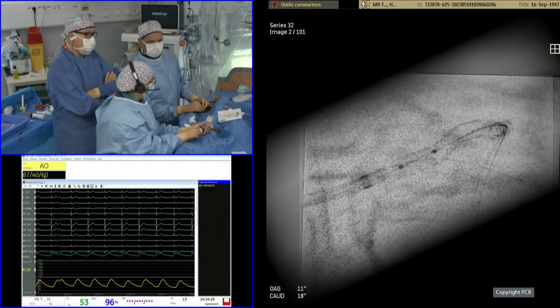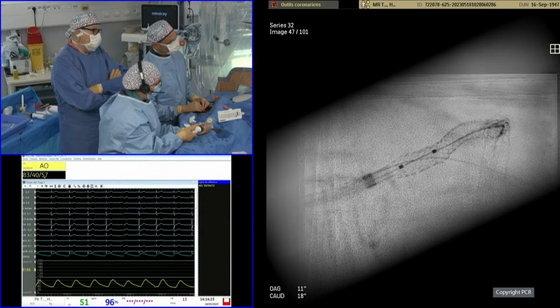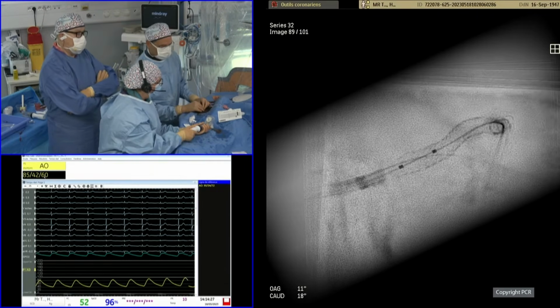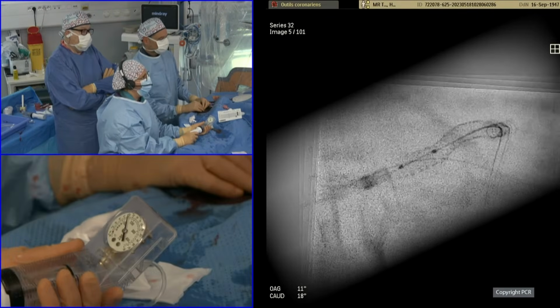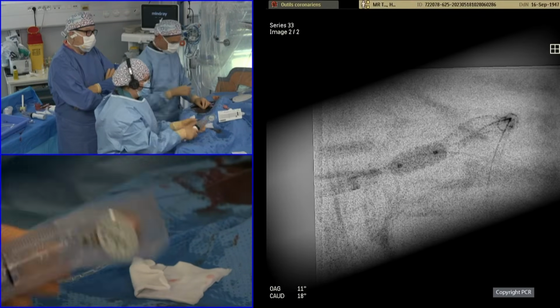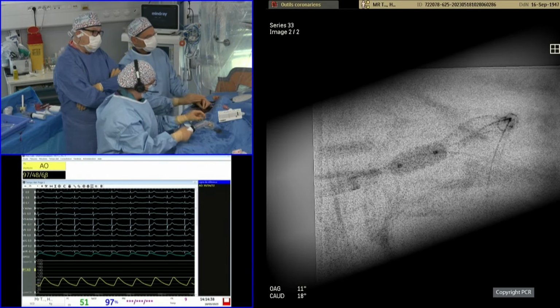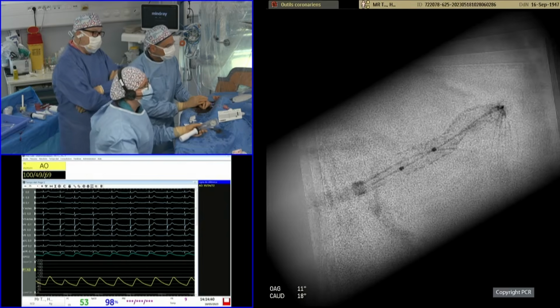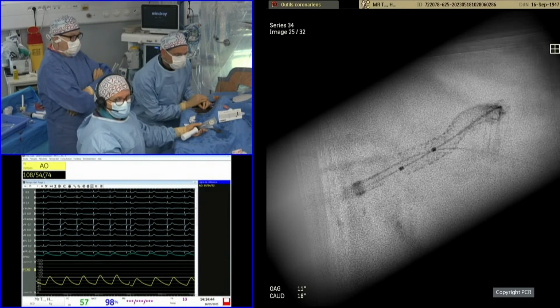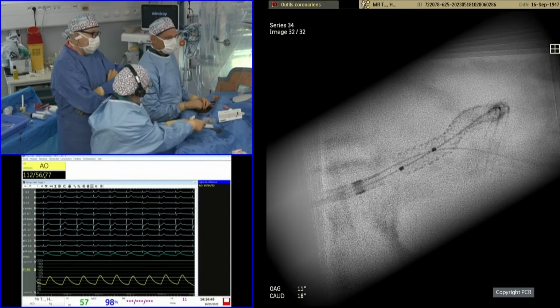OK, c'est bien là. C'est bien. Ouais. And you need to know the relationship between the distal and proximal markers and the balloon shoulders in order not to inflate outside of the stent. Okay, maybe we can do another stent boost just to check whether we have corrected this under-expansion. You can see the difference. Clearly now the proximal part is open.